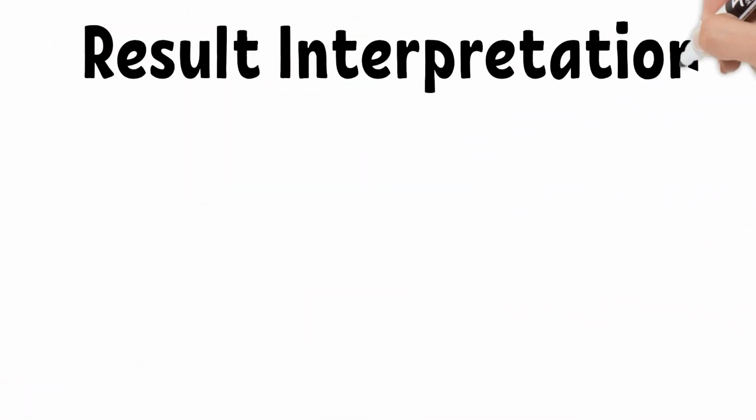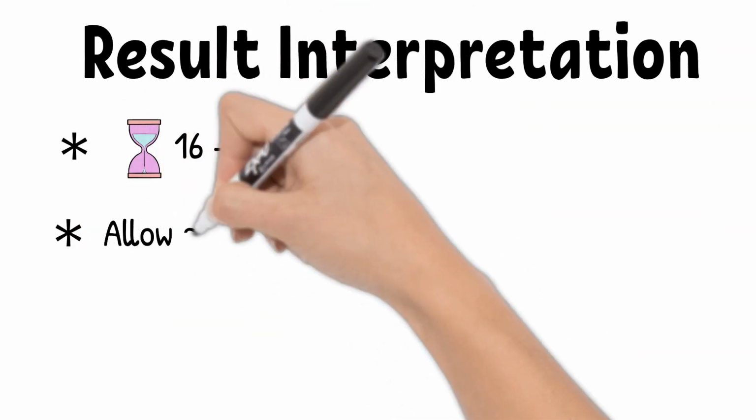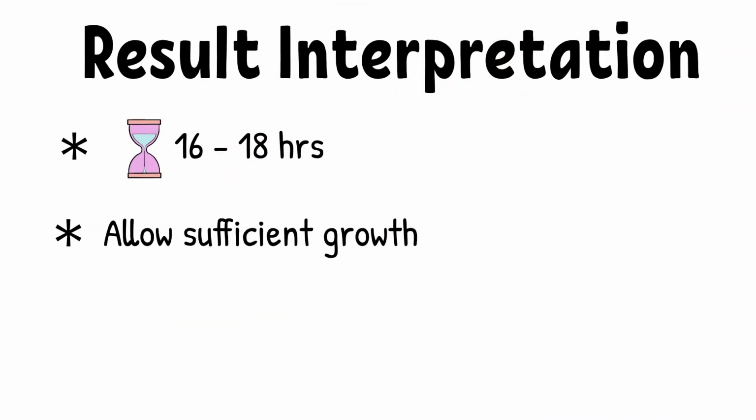After 16 to 18 hours, examine the plate to make sure that the organism has grown sufficiently. We do that by looking at the control plate. The organism must show growth that covers the whole plate or almost covers the whole plate. A control plate should be read prior to reading the patient plate.